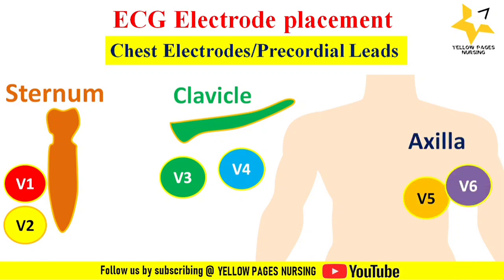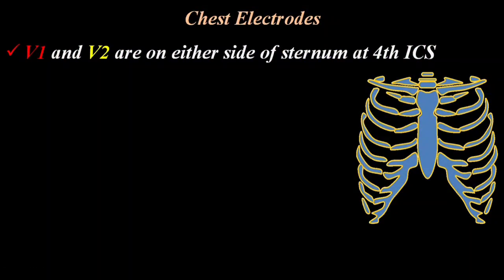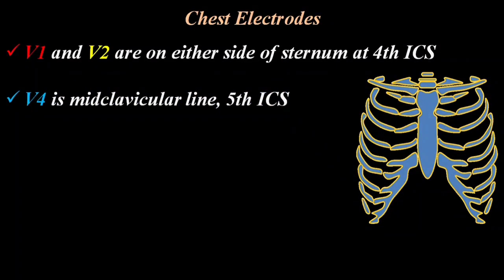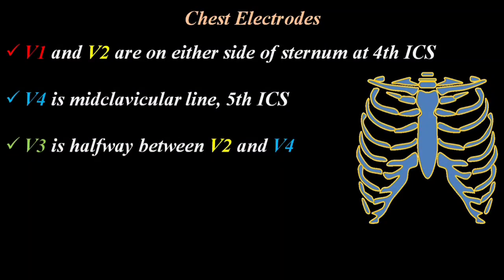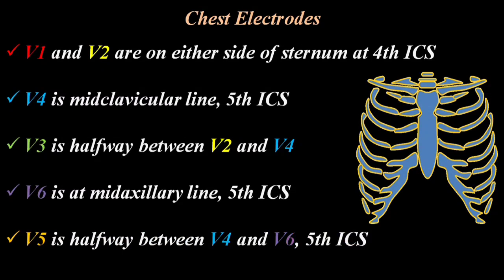V1 and V2 are placed on either side of the sternum at the fourth intercostal space — V1 on the right side and V2 on the left. V4 is at the mid-clavicular line on the fifth intercostal space. V3 is halfway between V2 and V4. V6 is at the mid-axillary line on the fifth intercostal space, and V5 is halfway between V4 and V6 on the fifth intercostal space.